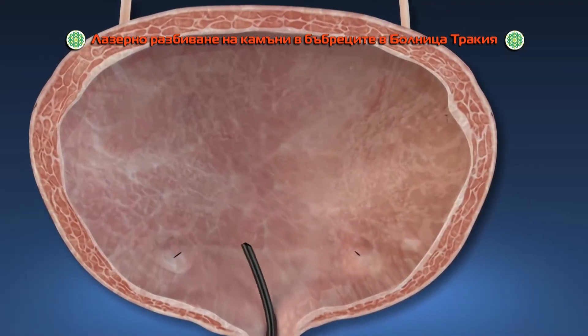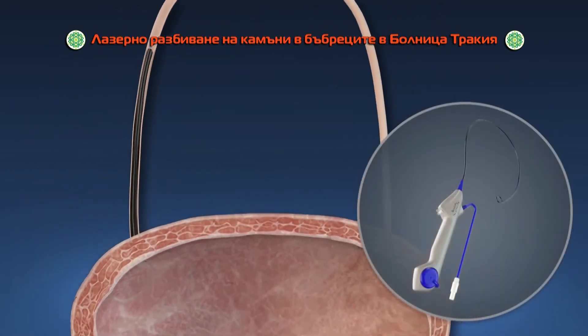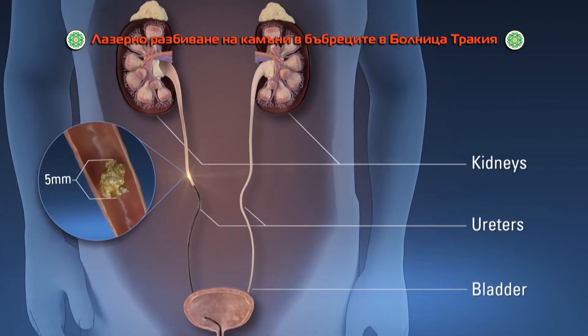Once you are under anesthesia, the doctor uses a videoscope called a ureteroscope to examine your urinary tract, including your kidneys, ureters, and bladder.